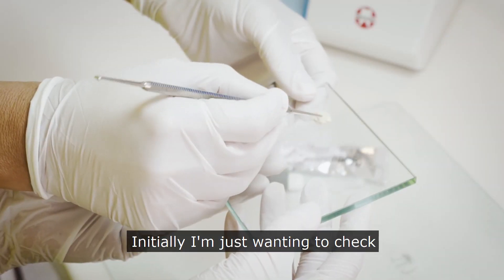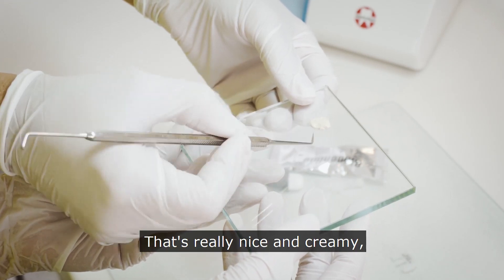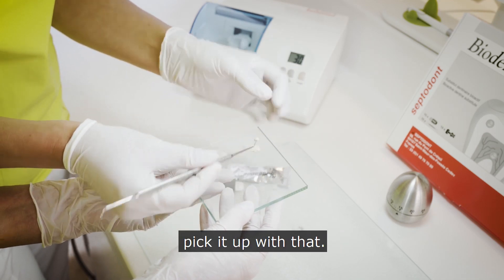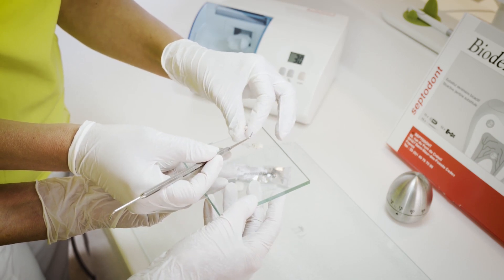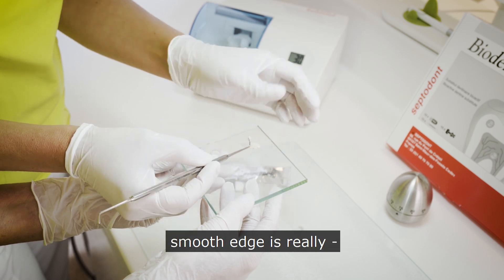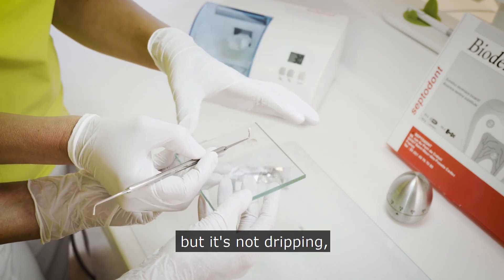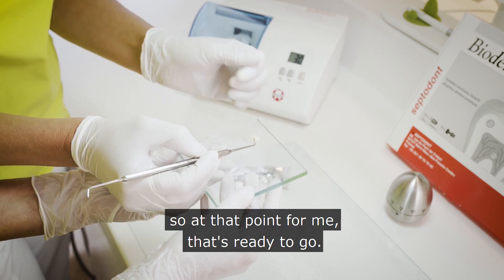Initially I'm just checking the consistency, making sure I'm happy with it. It's really nice and creamy — pretty ideal as far as I'm concerned. I separate a small amount out and I should be able to pick it up. I've started rolling because it's really nice to get a smooth edge — that's how I like to place it in the cavity. We've got a little bit of flow to it but it's not dripping; there's a good firm consistency. At that point, for me, that's ready to go.